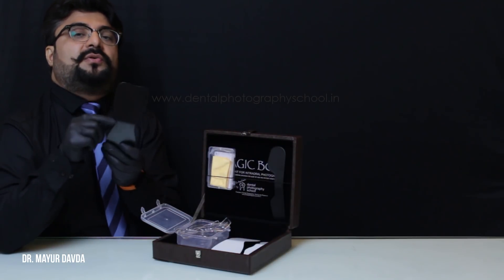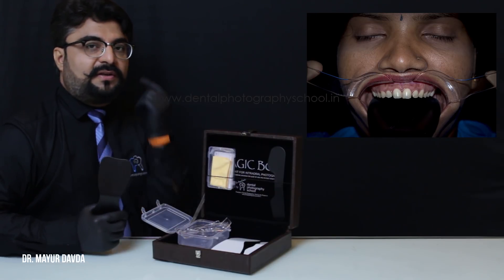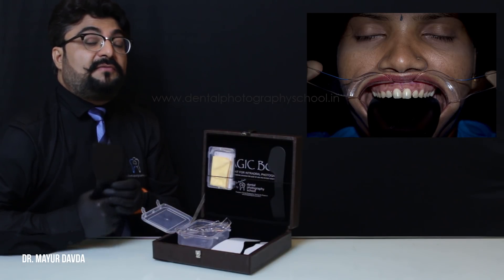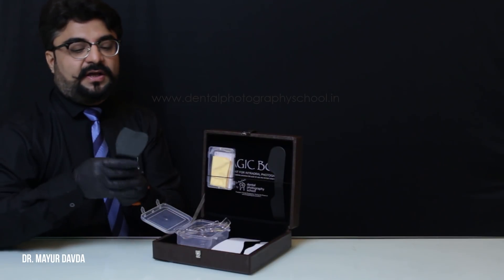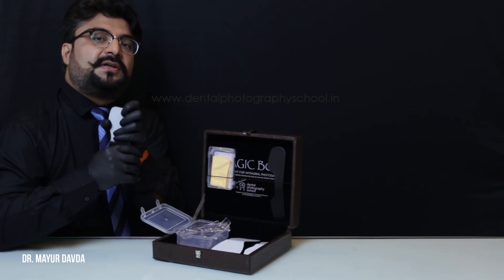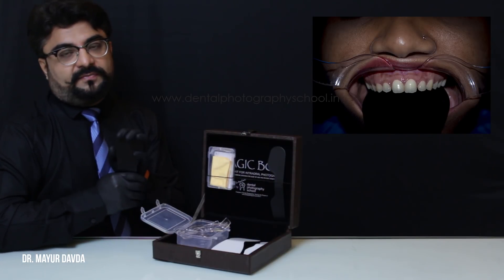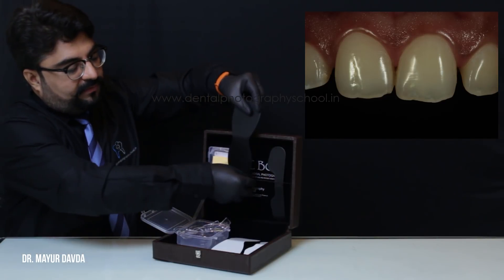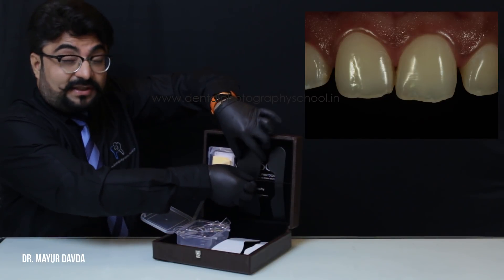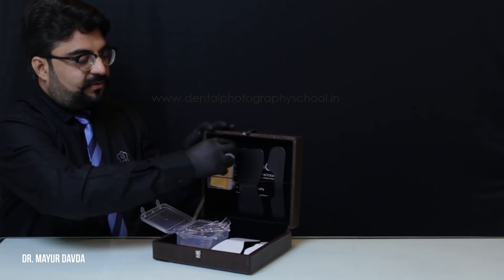Coming on to the full arch occlusal contrastor: people into digital smile designing usually require the full arch to be recorded in front of a black background — that's when we use the bigger side of the contrastor. For most routine aesthetic cases, I prefer to use the small side of the full arch occlusal contrastor. It does not give any glare; just in case it does, tilt it by one degree and the glare must go off.